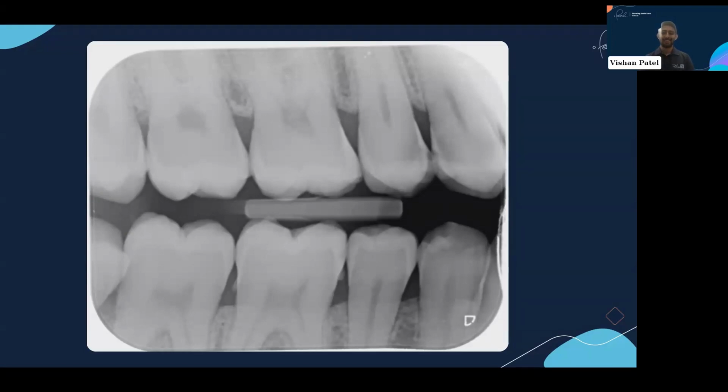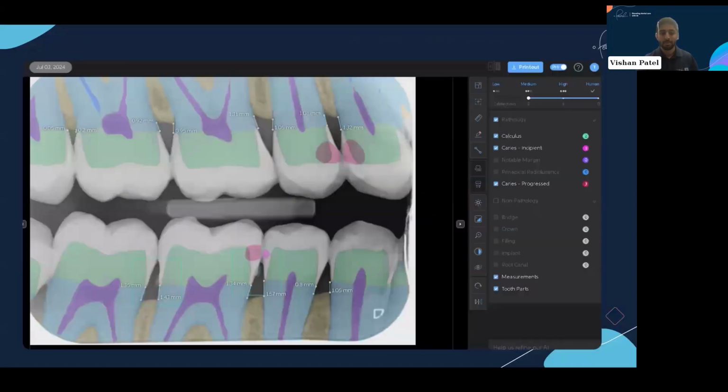All right, so essentially most of you, I would have hoped, spotted the caries in the upper right 4-5 region, and we can see these radiolucencies. For the small majority, you could see there's an enamel lesion on the lower right 5. And now essentially what I'm going to do is switch it to Pearl. We can see what Pearl thought.